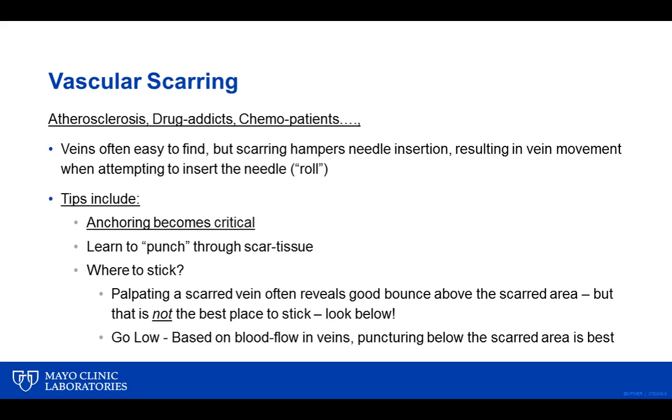We're better off going below. Look below the scarred area. That way the blood flow is not impeded. We're able to successfully collect the specimen. So on individuals like this, go low.